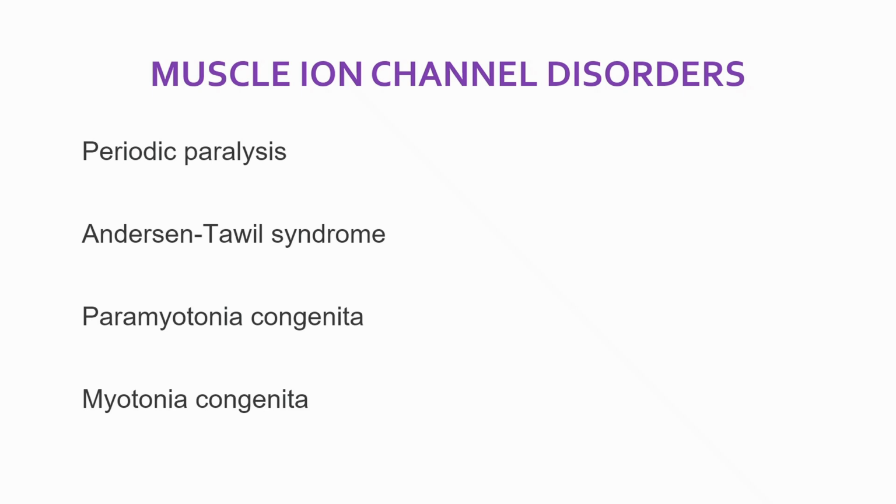myotonic disorders. So there are several ways in which we can analyse your DNA to look for a change that causes a channelopathy. So one of these is DNA sequencing. We look for alterations in all the genes that are associated with channelopathies. And we can also carry out family studies for the particular DNA change that has been identified in your family. So one of the methods of analysis which I'm going to focus on today is whole genome sequencing, or WGS.